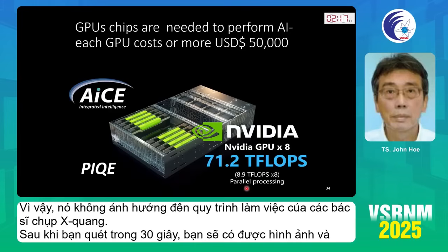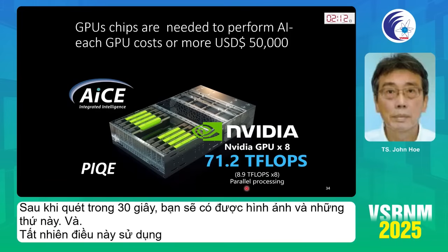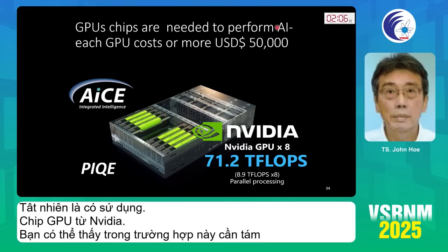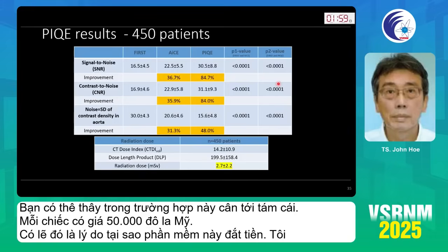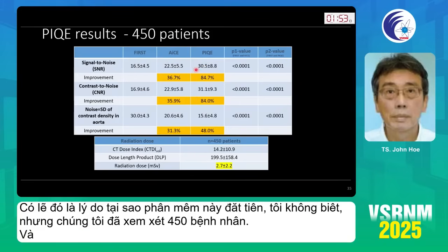And this, of course, uses GPU chips from NVIDIA. You can see in this case, it needs 8 of them. Each of them costs 50,000 US. Maybe that's why the software is expensive, I don't know. But we looked at 450 patients, and you can see the signal to noise ratio improved a lot.